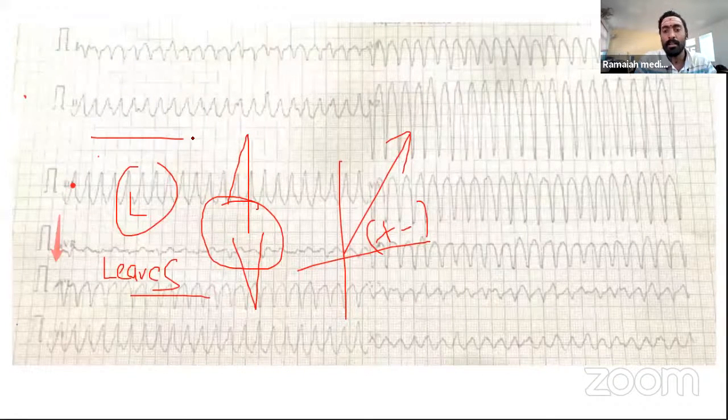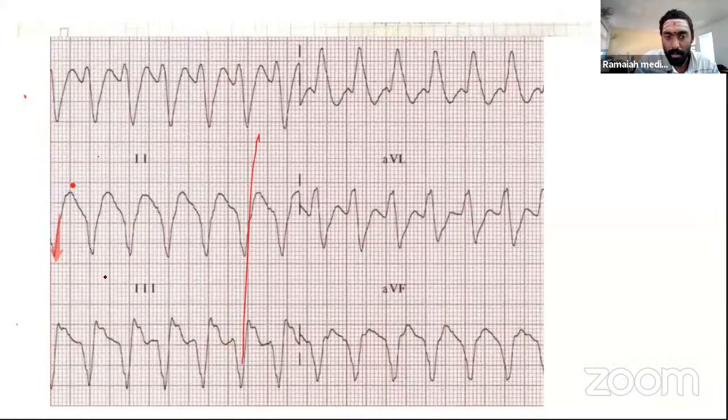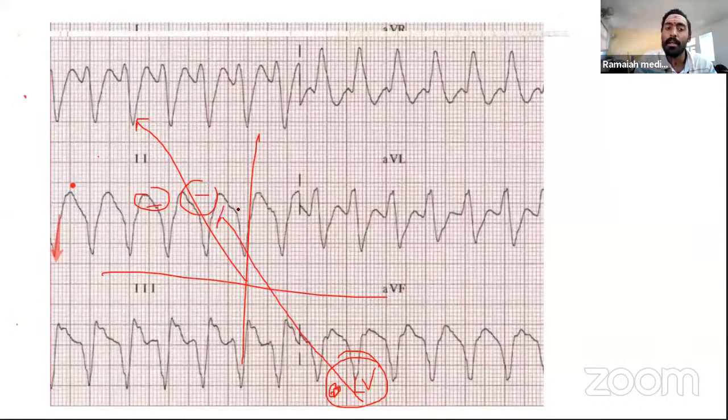Okay. So can you explain the extreme axis? Yeah, sure. Whenever we have a lead 1 which is negative and AVF is also negative, it's called an extreme axis. So can someone tell me from where should be the direction of activation? Let's say the origin is somewhere here, from the LV apex there is an activation and it is going towards the AVR.